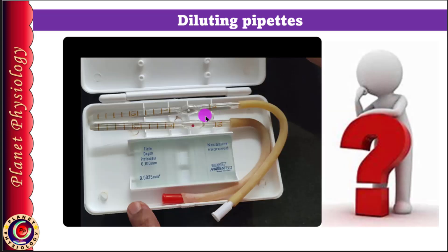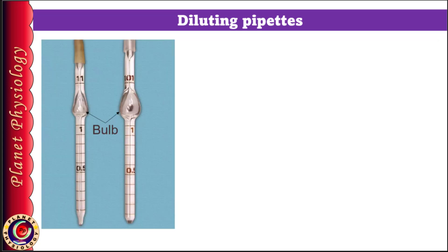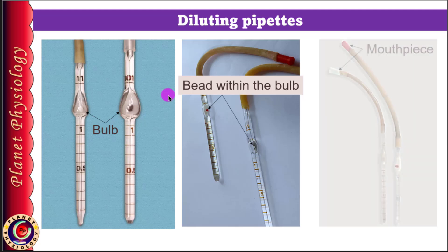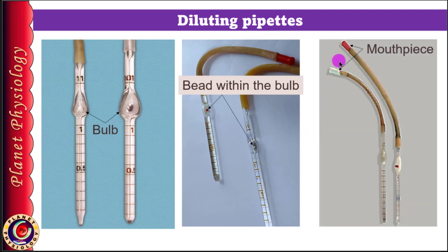At this moment, take a pause and observe both these pipettes. Do you find any similarities and differences among them? Note your findings and then resume. You must have noted that both pipettes look similar, but one has a bigger dilatation called the bulb. Some of you might have noted there is a small bead within the bulb which differs in color. Some might have noted differences in the numbers mentioned on the pipettes, and another quick observation could be the color difference in the last part of the pipette. If you noted all these four points, you are a keen observer.